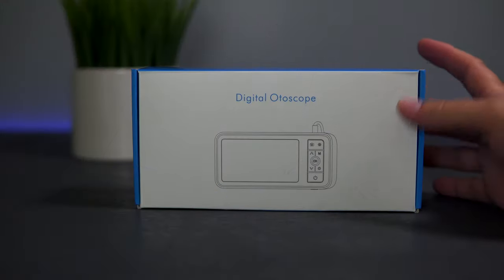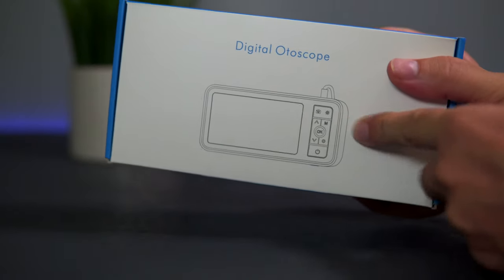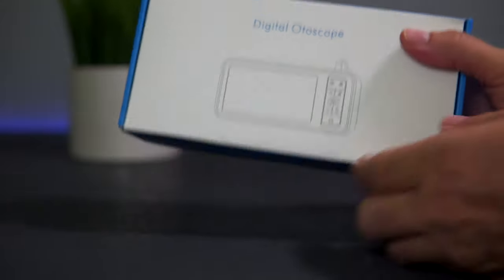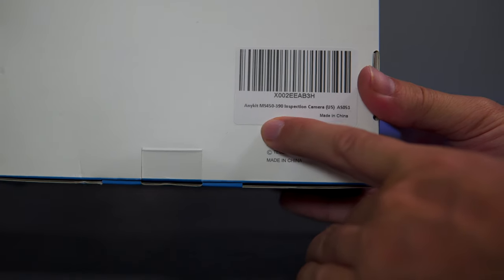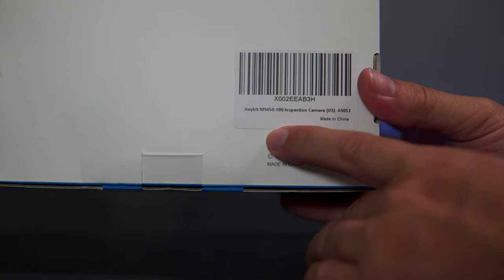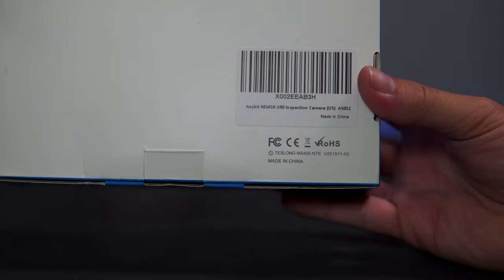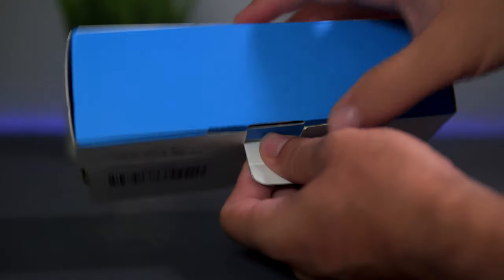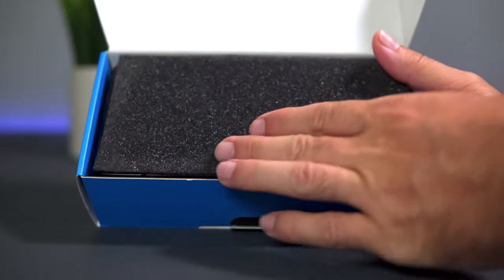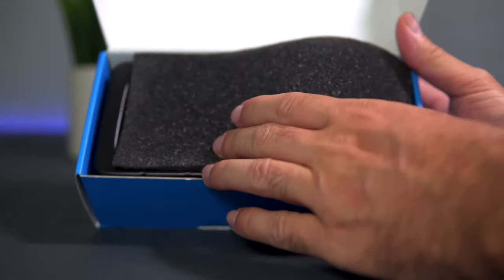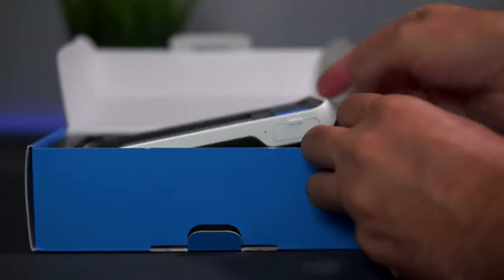This is the box that it comes in. We've got a nice little picture here that shows what's inside. It's offered by a company called Anykit, model number MS 450-390. Let's see what it looks like. There's a little foam pad on top.